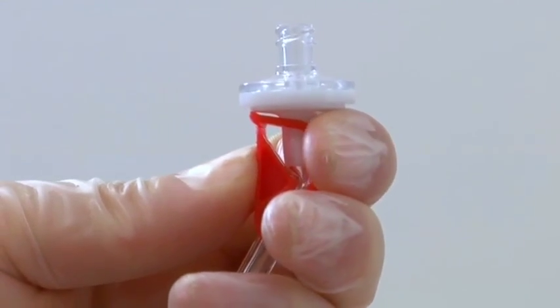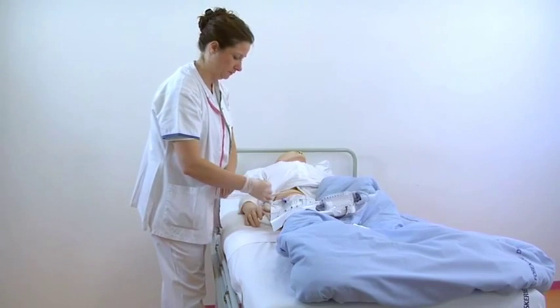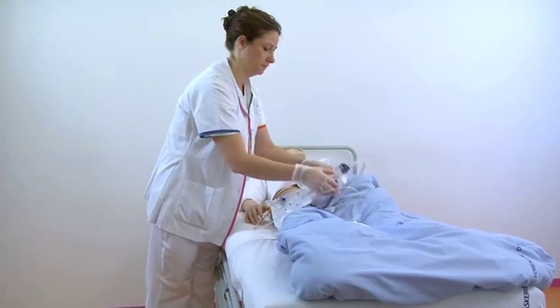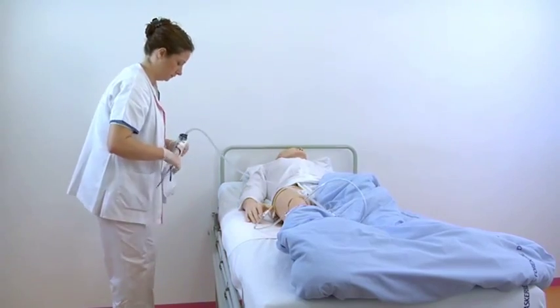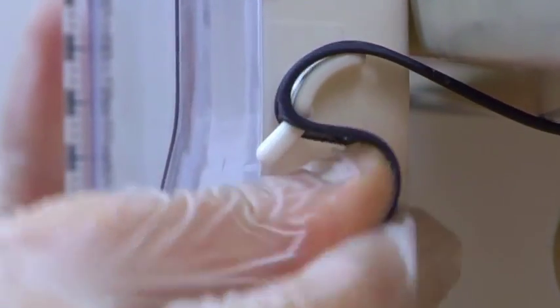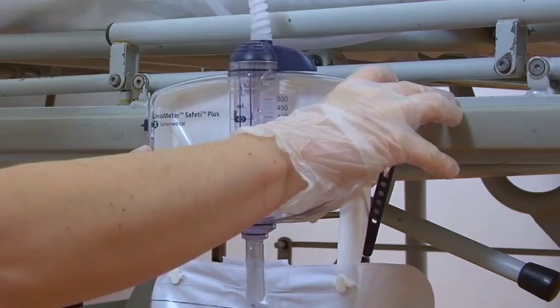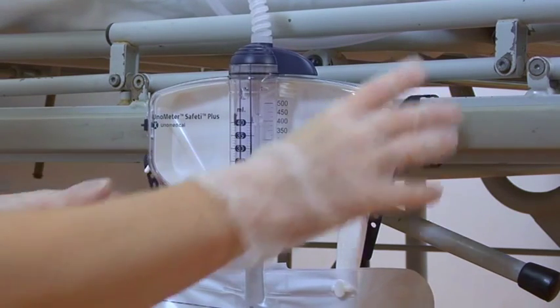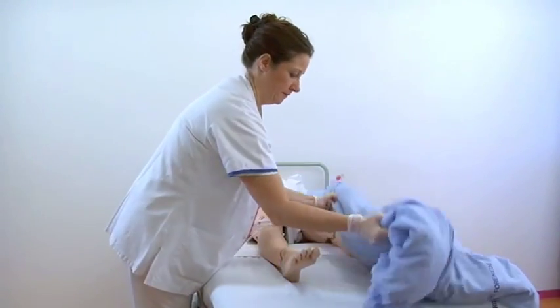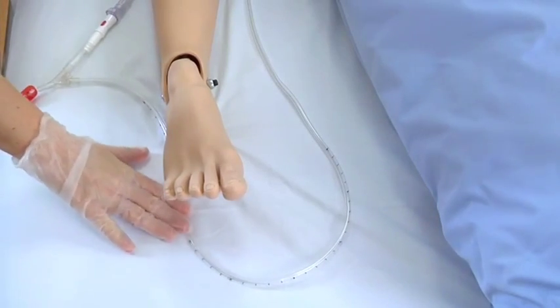Close the red clamp. Make sure the unometer is attached correctly to the bed. Make sure the patient is lying down in a supine position. Then place the unometer abdo pressure around the leg of the patient and make sure the tube doesn't kink or make a loop.